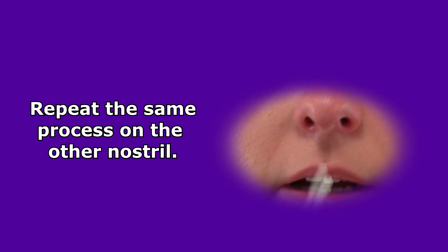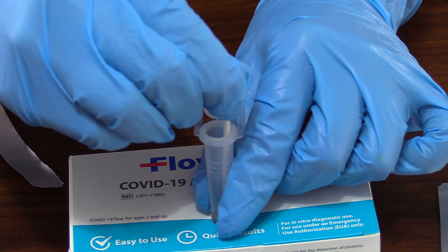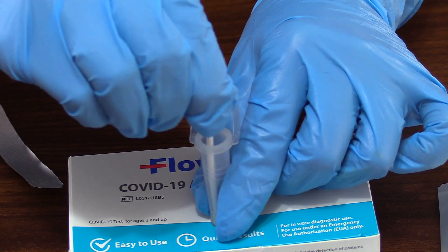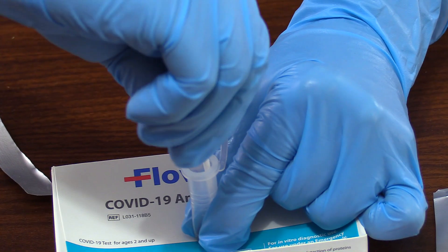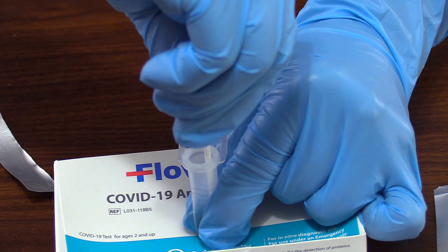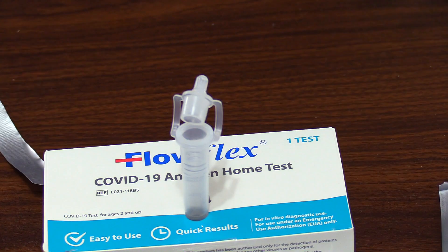Then remove the swab from the nose and place it in the extraction buffer tube. Swirl the swab around in this solution for 30 seconds. Once that's complete, squeeze the tube and rotate that swab around five times. Then while still squeezing the tube, remove the swab and dispose of it.